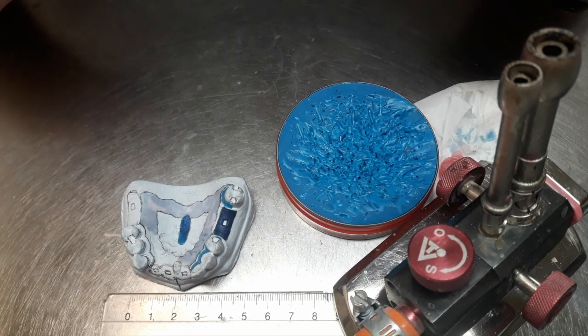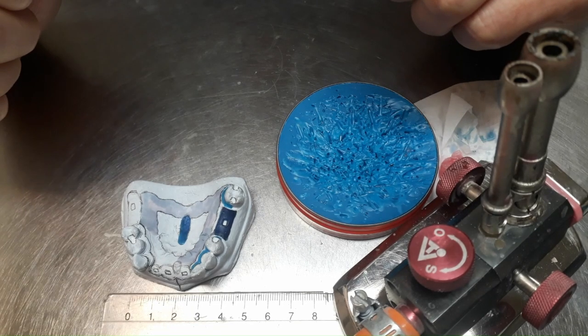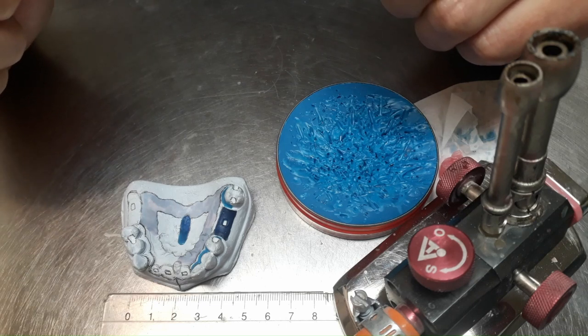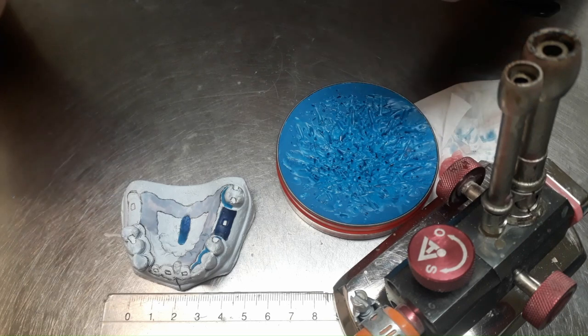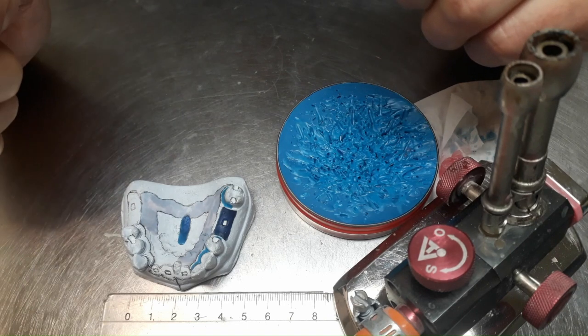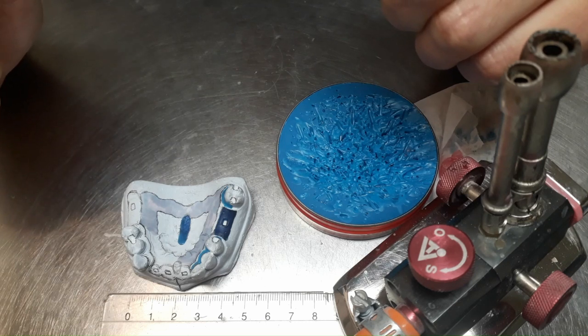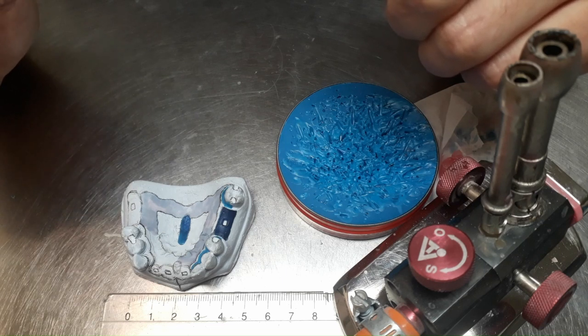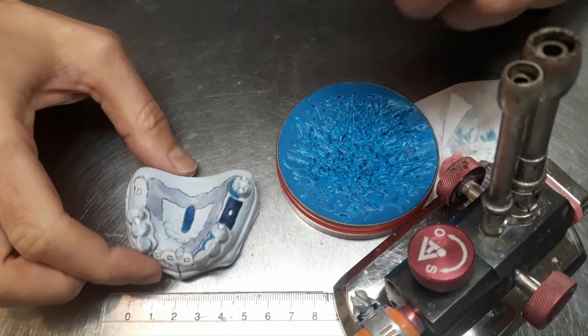I'll show how the master model is being duplicated. You can divide this in 3 stages. The first is eliminating the undercuts and foiling the master model, placing foils on it. The second is getting the negative copy of this prepared or modified model. And third stage is to pour the investment material to get the duplicate model.